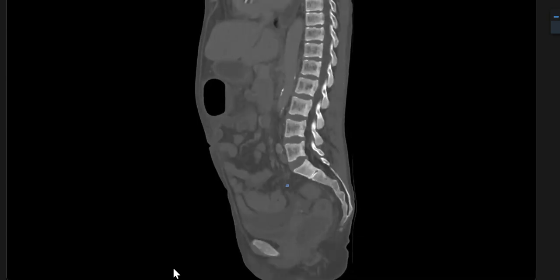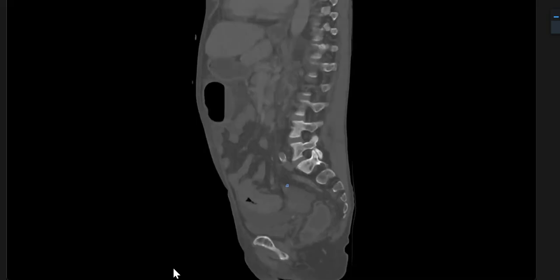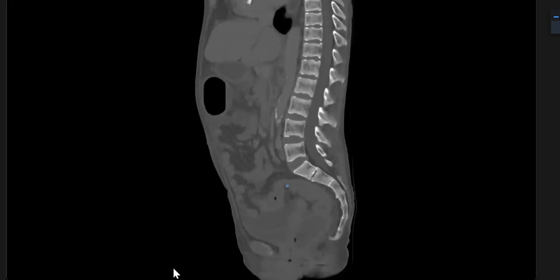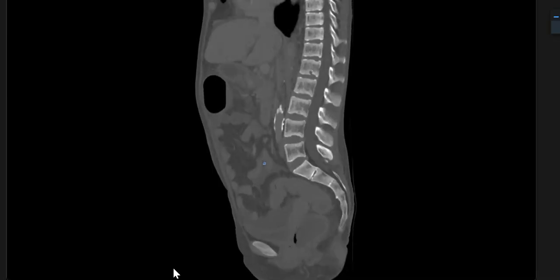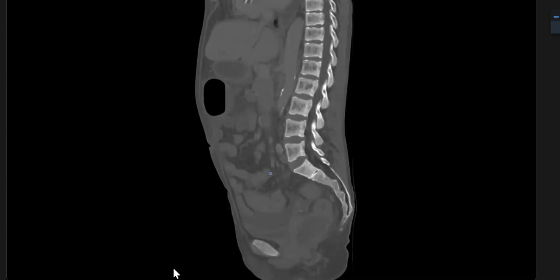But the current study is suggestive of acute intestinal obstruction with an imminent rupture. I would urgently communicate the findings to the gastroenterology surgical unit on call to assess the patient's status. So you will tell the surgeons to assess the patient's status. Surgeons are relying on you for a report. What do you write in your report? So there is an intestinal obstruction at the level of the transition zone at the right iliac fossa, which urgently needs a laparotomy.